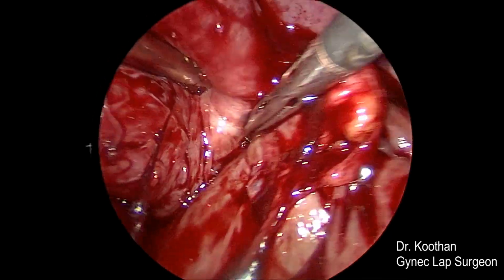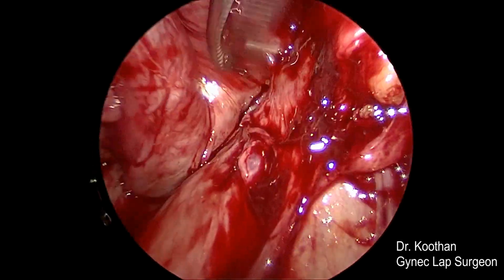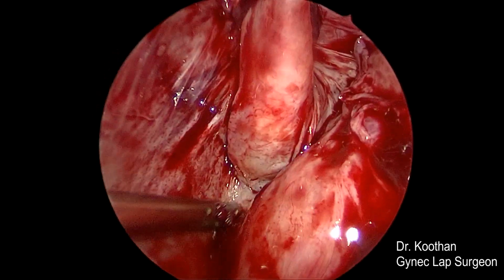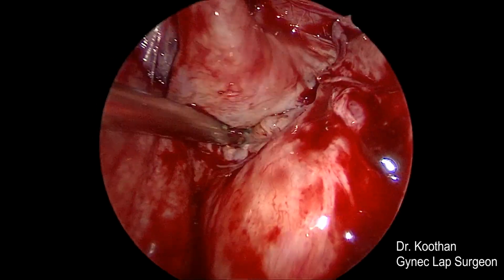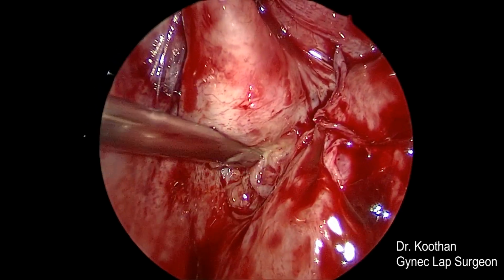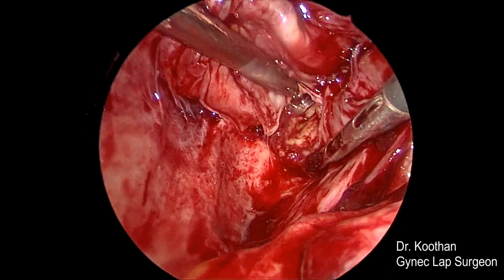So now releasing the posterior compartmental adhesions between the mesorectum and the Pyosalpinx. It is densely adherent. This is the pelvic wall. Now you can see the pus coming out of the tube.